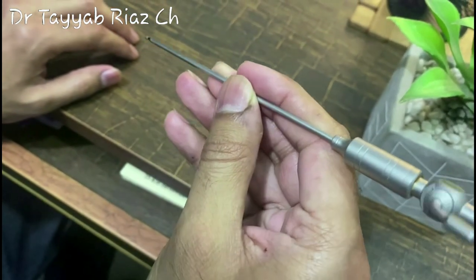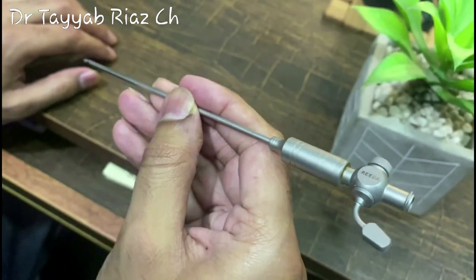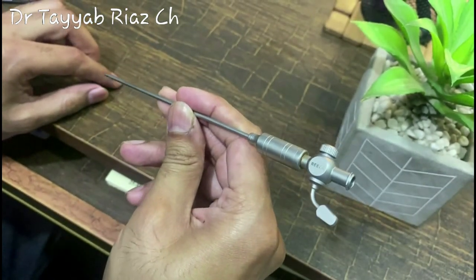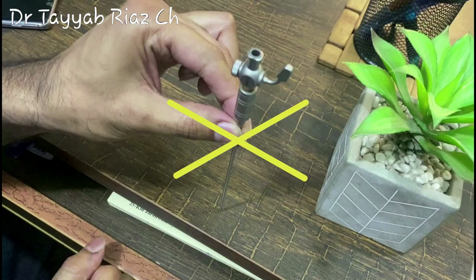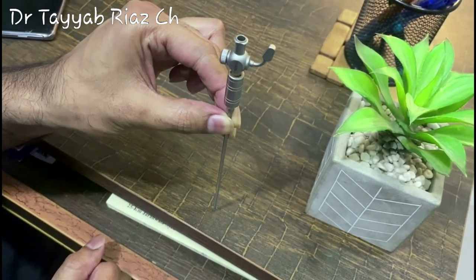One is that there is automatically the 45 degrees angle, and this angle is very important to prevent any injury to the intra-abdominal structures like gut and, more importantly, the aorta and the vena cava. So the entry should not be in the vertical direction to either the skin or the patient. It should be avoided, and the direction should always be towards the anus, that is 45 degrees.